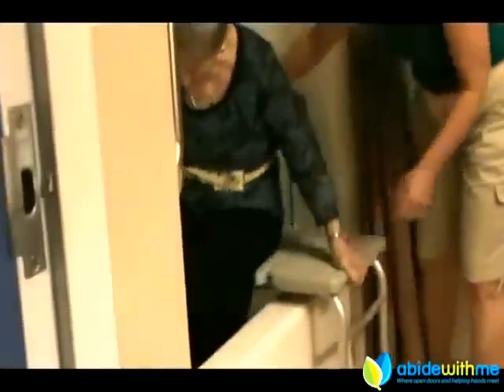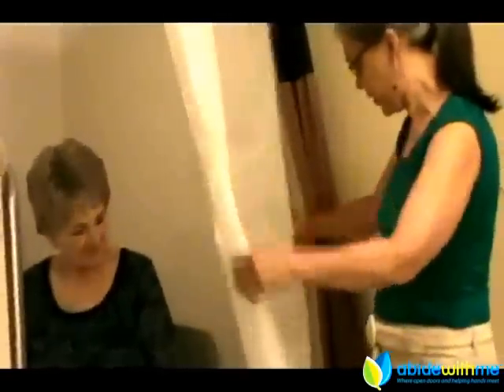Now turn that direction and while you're doing that, go ahead and lift that right leg over the edge of the tub. Now you can start to scoot over while you're bringing the other leg in, and get all the way over there. Now, because you're going to get water on the floor using the shower like this, what we generally do is cut some slits in the shower curtain so we can just tuck it in like this to help contain the water.